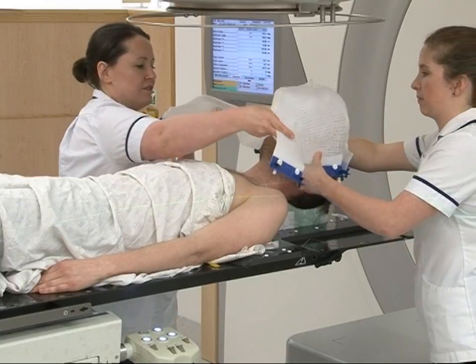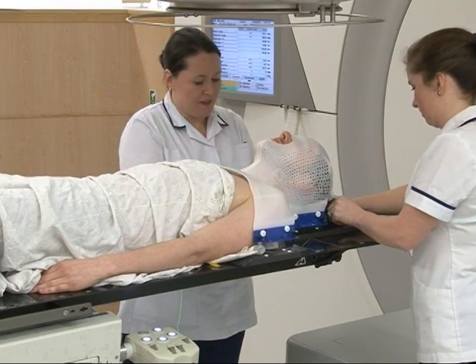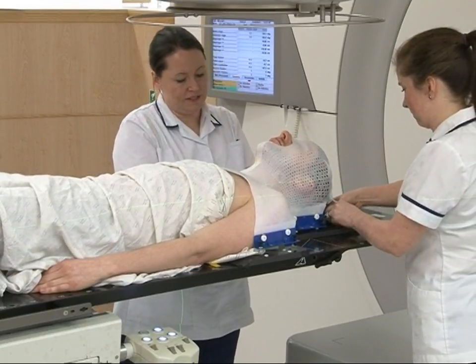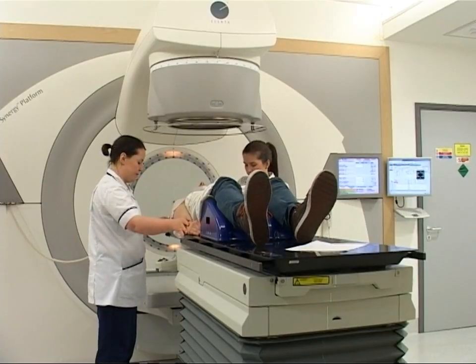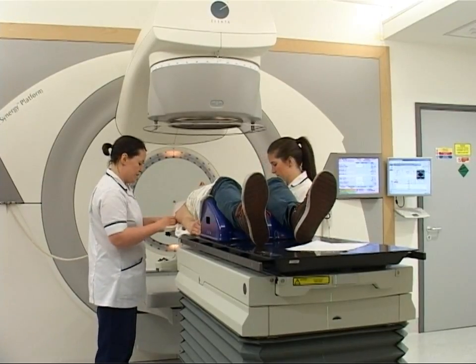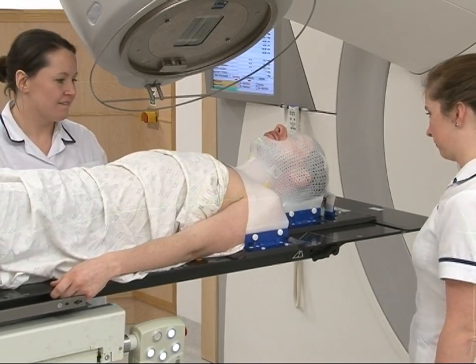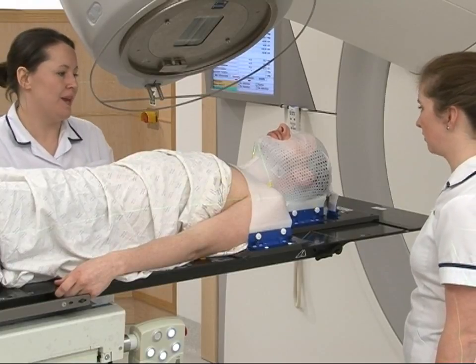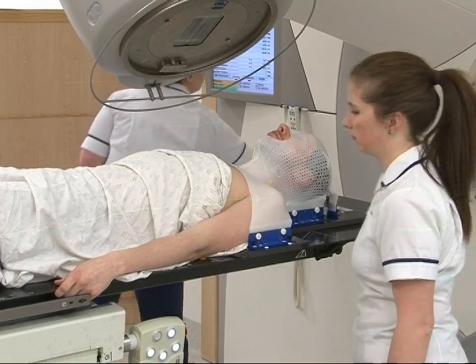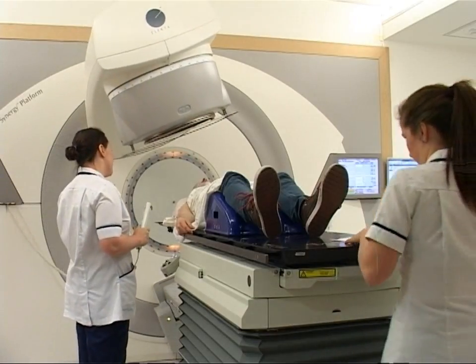You will need to wear your mask for each treatment. Treatment times vary depending on the type of treatment planned for you and can be from 10 to 30 minutes. Radiotherapy itself is painless and does not make you radioactive. It is perfectly safe for you to be with other people, including children, throughout your treatment.